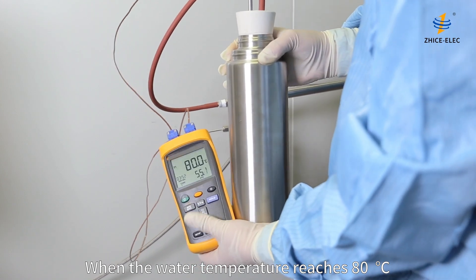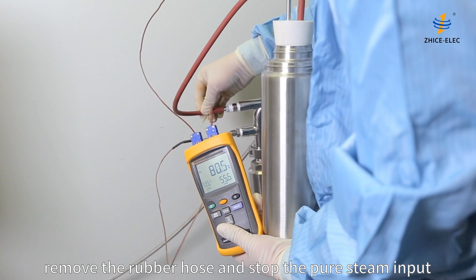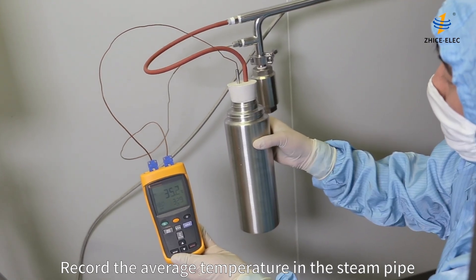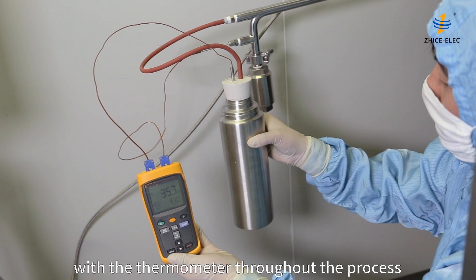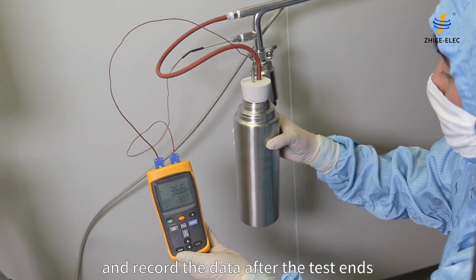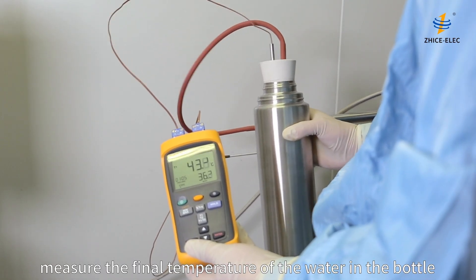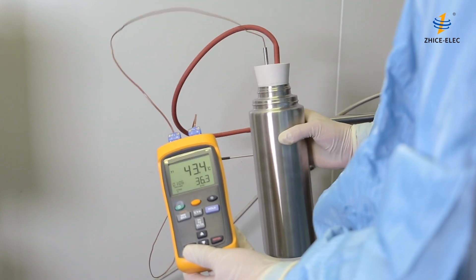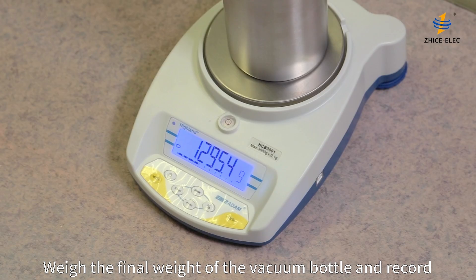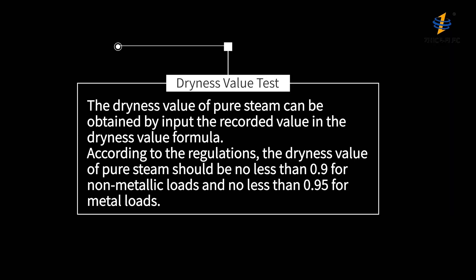When the water temperature reaches 80 degrees Celsius, remove the rubber hose and stop the pure steam input. Record the average temperature in the steam pipe throughout the process and record the data after the test ends. Check the vacuum bottle, measure the final temperature of the water in the bottle, and record. Weigh the final weight of the vacuum bottle and record. The dryness value of pure steam can be obtained by inputting the recorded values into the dryness value formula.